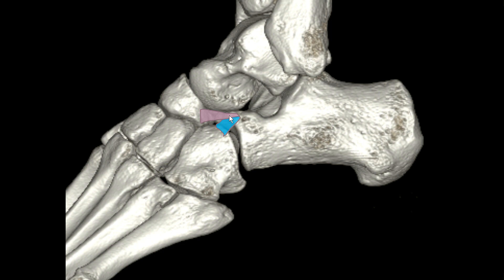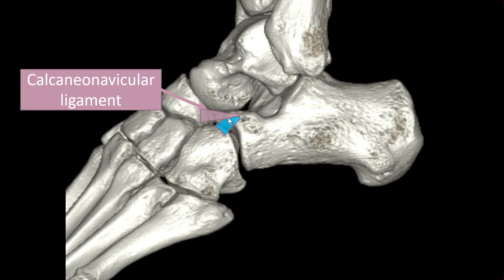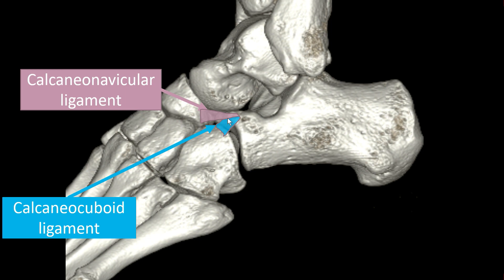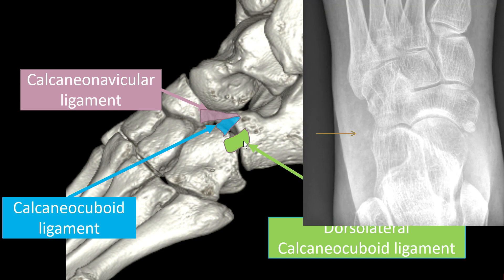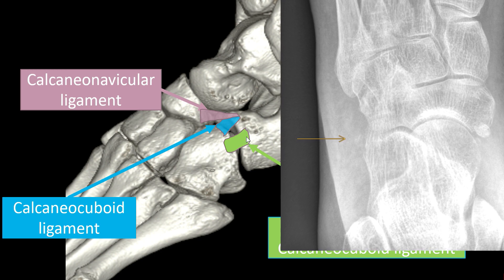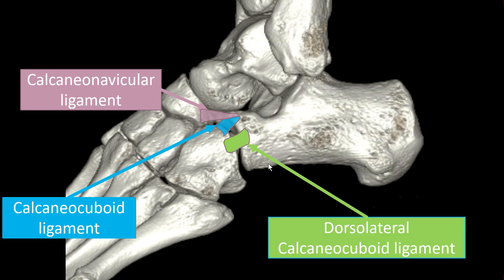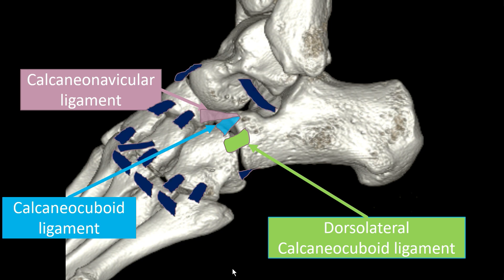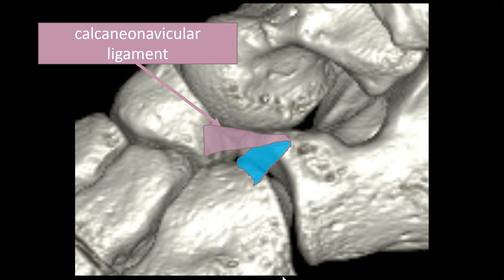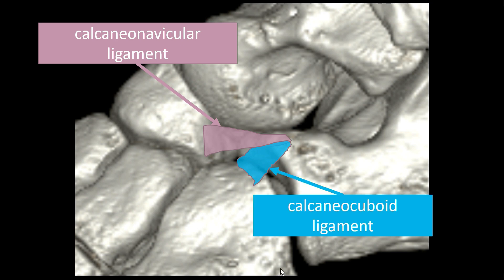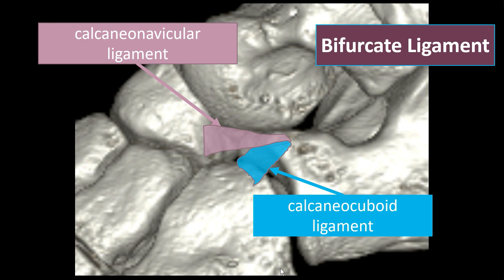The ligament runs to the lateral aspect of the navicular bone, and the second component runs to the cuboid bone. This is called the calcaneonavicular ligament — sometimes also called the lateral calcaneonavicular ligament — and this is the calcaneocuboid ligament. There is also a dorsolateral calcaneocuboid ligament where you sometimes see tiny avulsion fractures. Both together — the calcaneonavicular and calcaneocuboid ligaments — make up the bifurcate ligament.